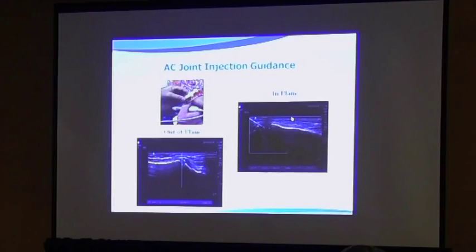Or it can be done in plane. And this one, the needle's already in, but you'll see the injectate going in there. There you go.